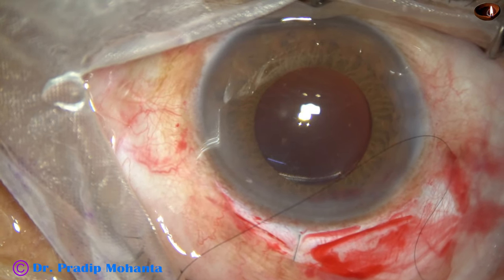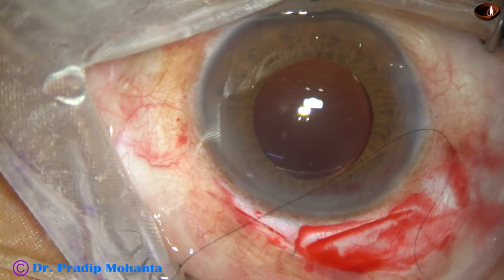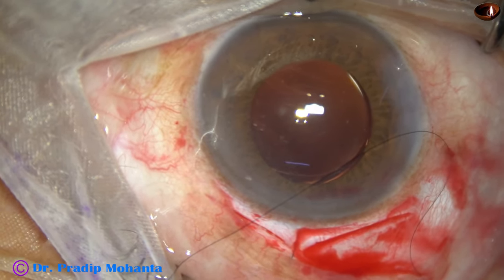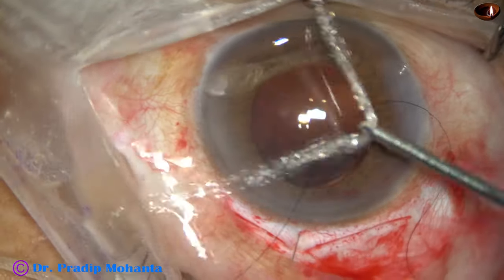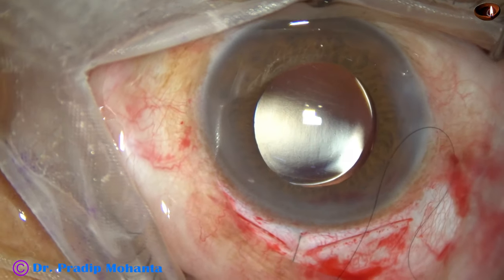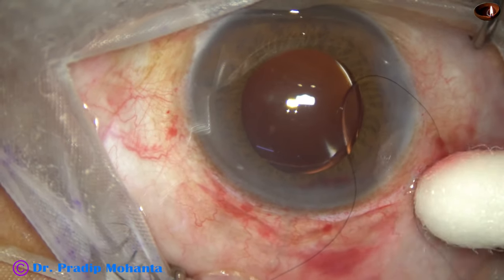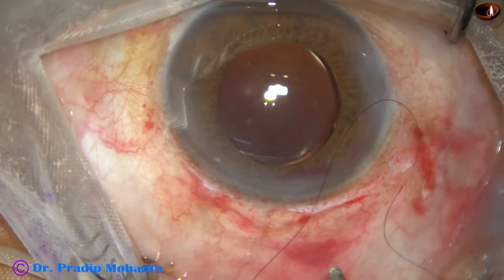The anterior chamber is nicely formed with the help of the Simcoe cannula. The pressure is checked and is okay. Some more hydration is done and the intraocular pressure is fine. The anterior chamber is forming well with the irrigation cannula. The eyeball is firm, with no leakage from anywhere — not from the main wound, not from the side port — and we are towards the end of the surgery.